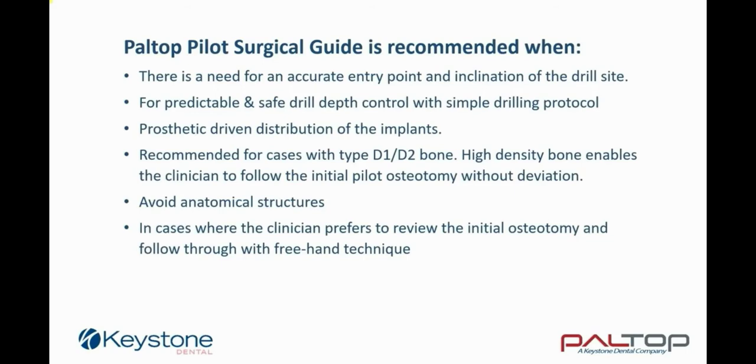When is a pilot surgical guide recommended? When there is a need for an accurate entry point and inclination of the drill site. For predictable and safe drill depth control with simple drilling protocol. For prosthetic-driven distribution of the implants. It is recommended for cases with type D1, D2 bone. High-density bone enables the clinician to follow the initial pilot osteotomy without deviation. Use a pilot guide to avoid anatomical structures. And for cases where the clinician prefers to review the initial osteotomy and follow through with freehand technique.